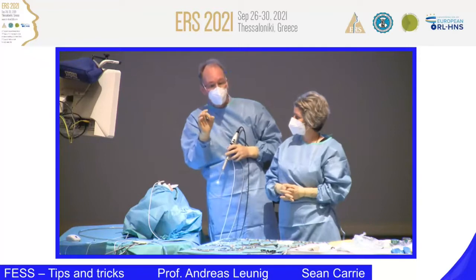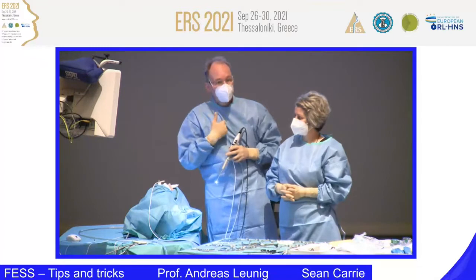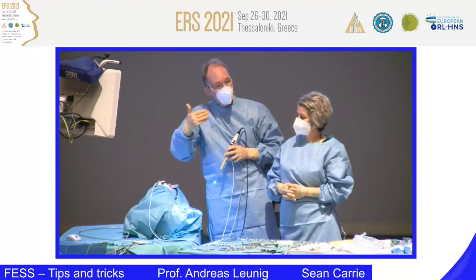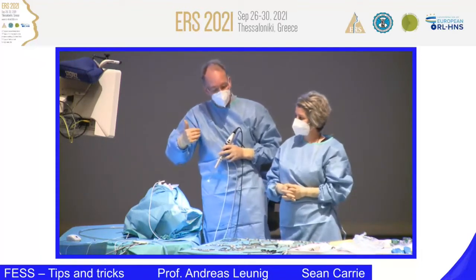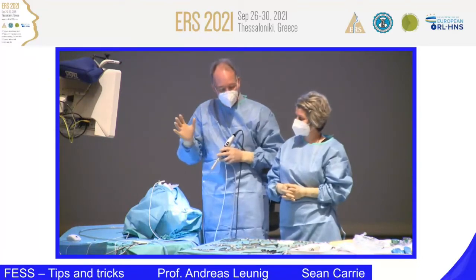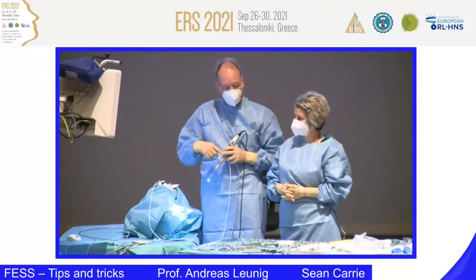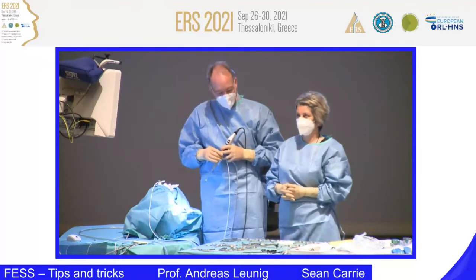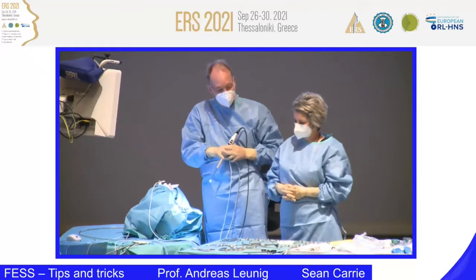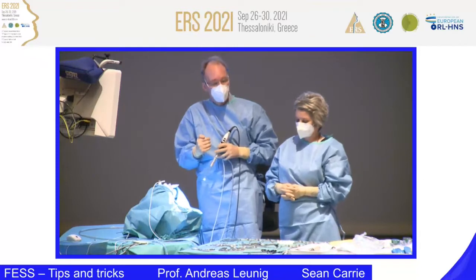And when you go around the corner to the maxillary sinus or to the frontal, I personally use the 45-degree endoscope. Heinz Stammberger used the 30 for many years, but then the 45-degree endoscope came. Both endoscopes are fine. In rare cases, we use a 70-degree when you have to look into the maxillary sinus to the alveolar recess if there's any pathology. The instruments you will see during the dissection, step by step, and I will describe how they work and when you should use them.